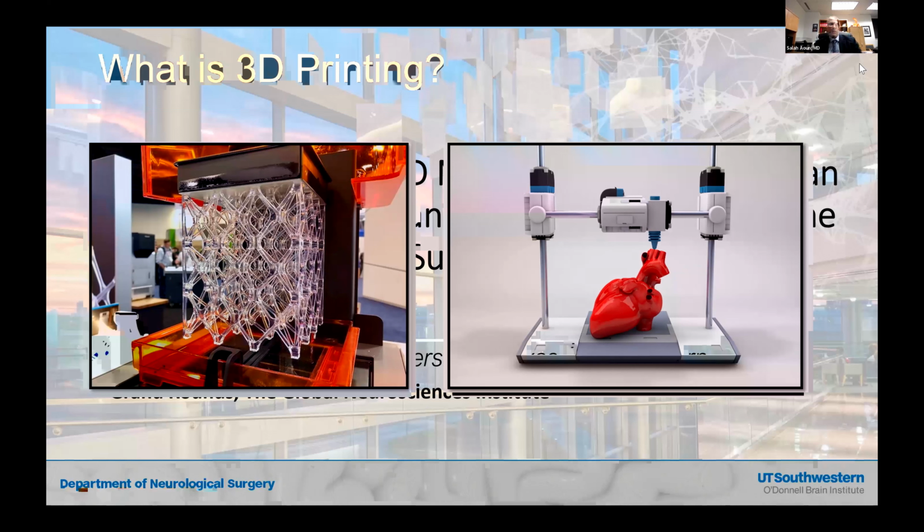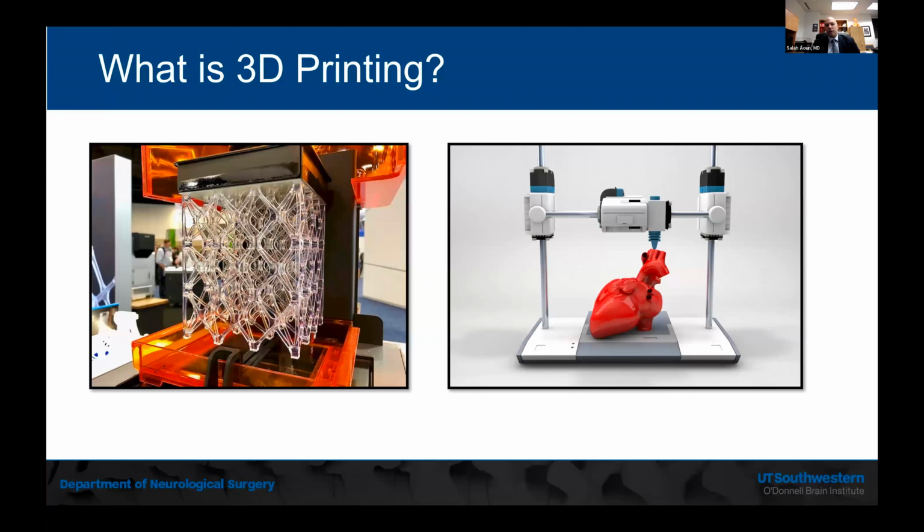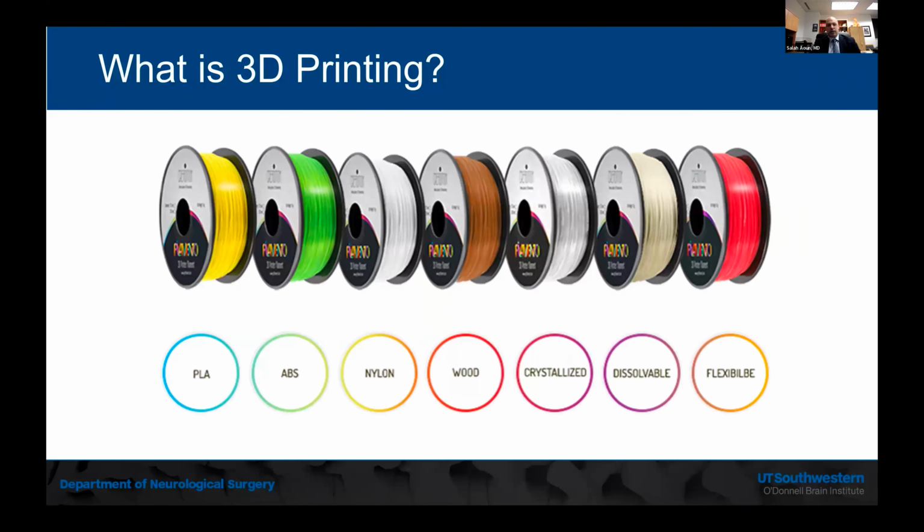When we talk about 3D printing, this is what people usually think about. They either think about a resin-based 3D printer where the model comes out where you manage to make small figures, usually under 10 inches, or about an extrusion system where you have a single extruder or double extruders building the model from the base up. And that is, for the most part, true, but it's become much more involved and complicated.